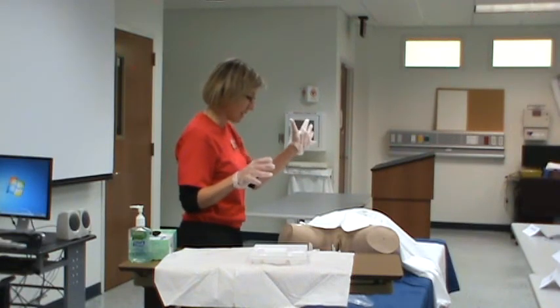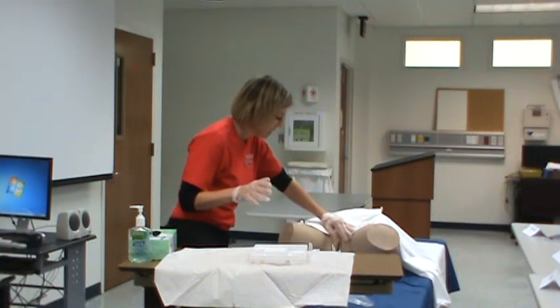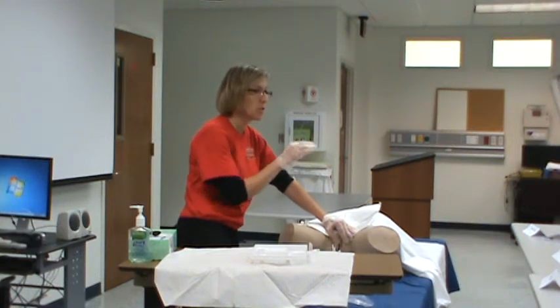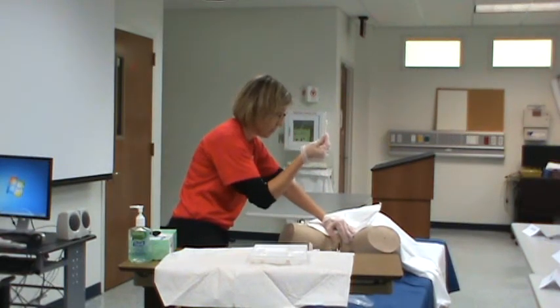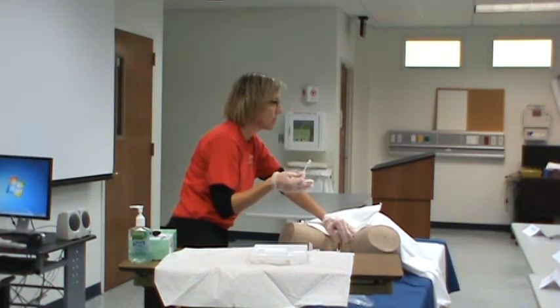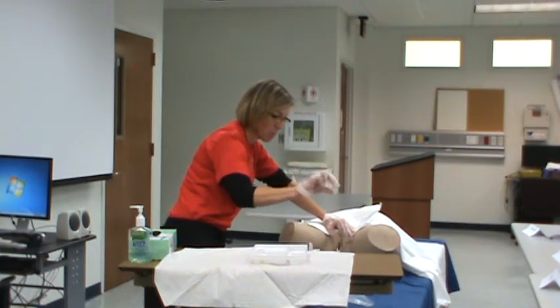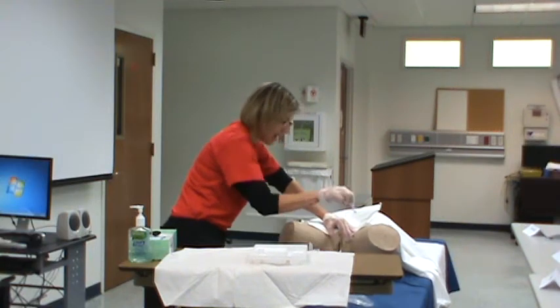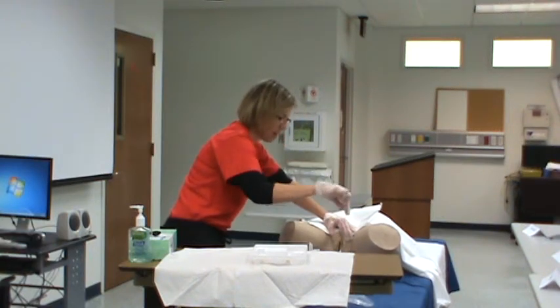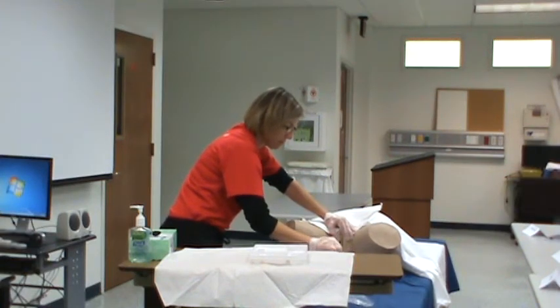So I'm getting ready, and again, in the mannequins a little bit differently than in a real person, but you will take your hand and you will spread the labia minora to expose the area that you're going to clean. You're going to take one of the Q-tips if you've got the saturated Q-tips, or the betadine swabs if you've got those, and we're going to do outer first. And then you go outer first, then inner, coming to me, meaning the inner edge towards me. And sometimes I do that. When I don't use that, I just put it right there because it's not going anywhere. And then one more right down the middle.